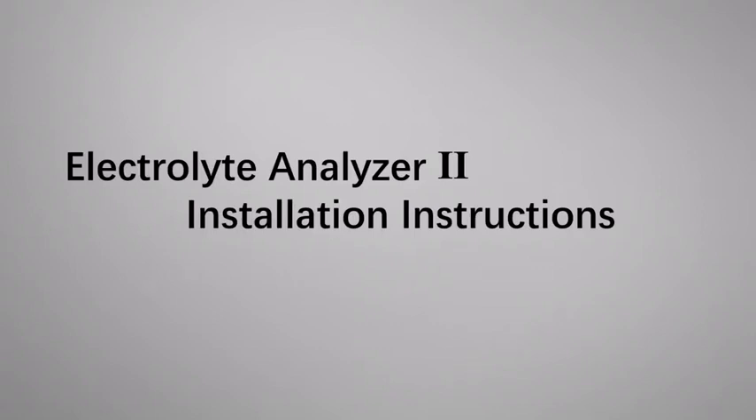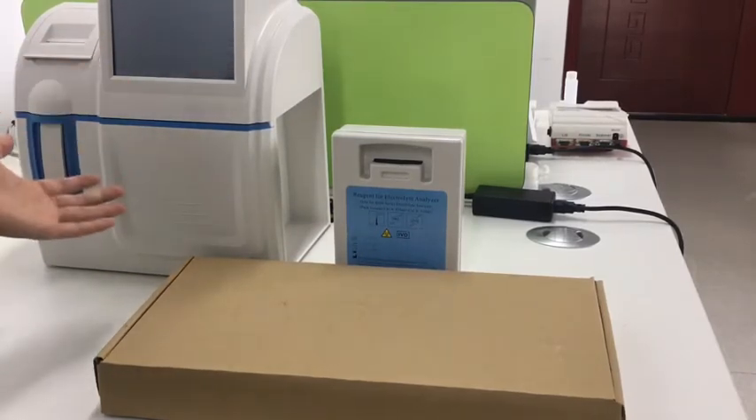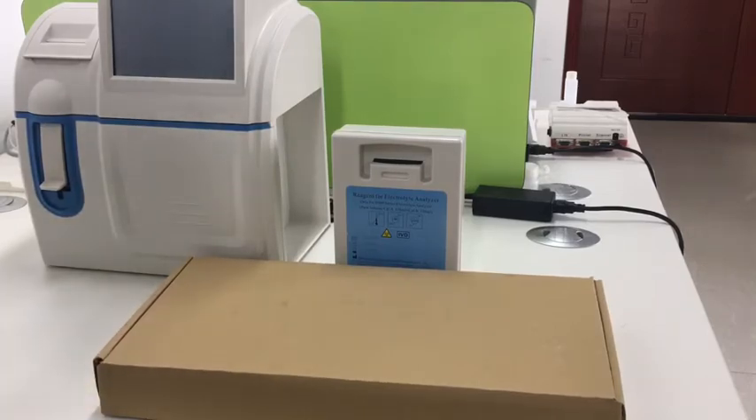This video will show how to do the installation for the electrolyte analyzer. First we take out the main machine, reagent pack and accessory, and put them on the table.